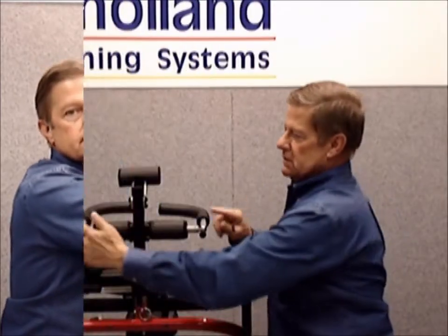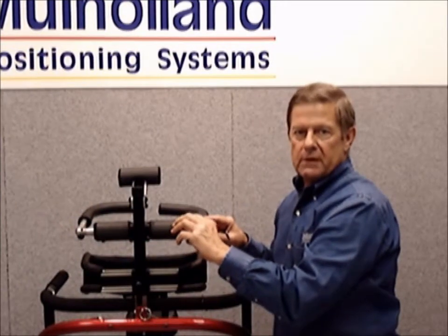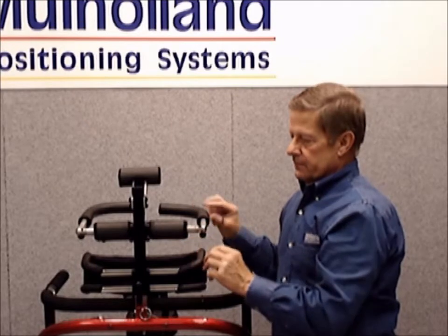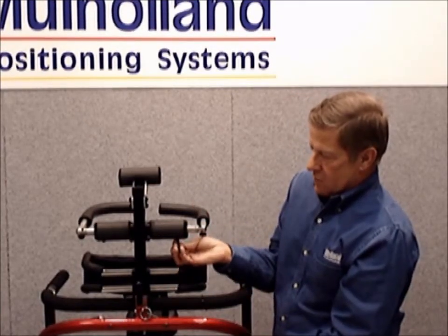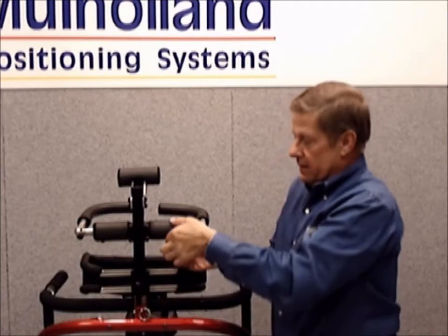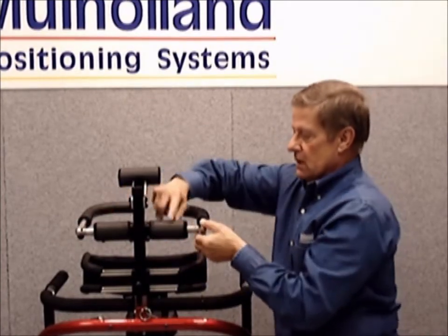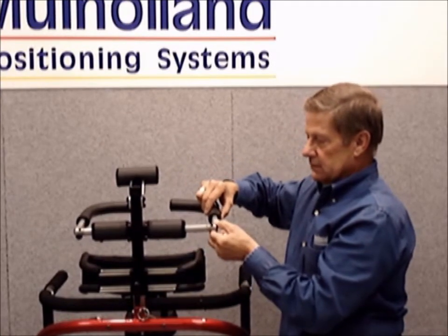Next, we want to adjust the width of the thoracic pad. That measurement, again, using page 15 of your user's manual, is number 3. On the bottom side of the front portion of the thoracic support, there's an Allen screw on each side. One here, located here. We want to loosen that Allen screw. That will allow us to adjust the width in and out of the thoracic ring.